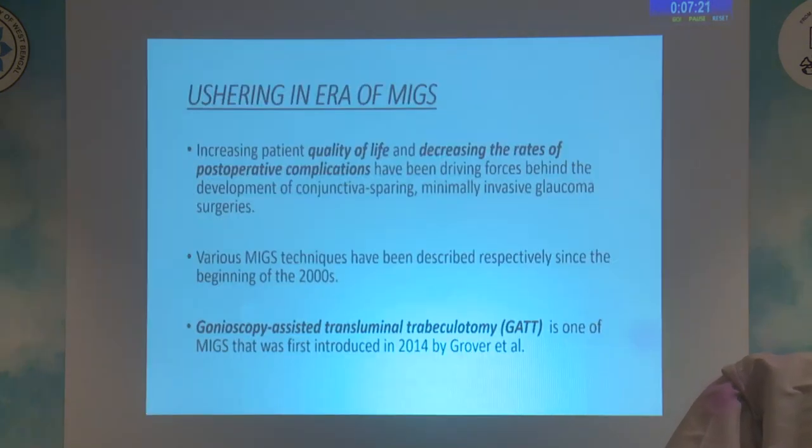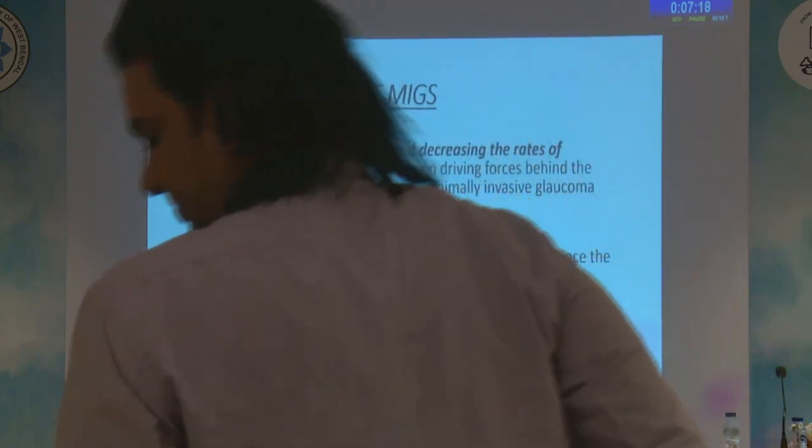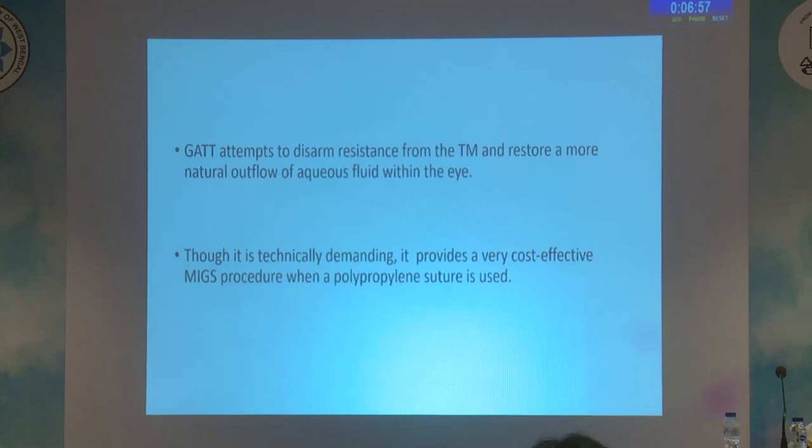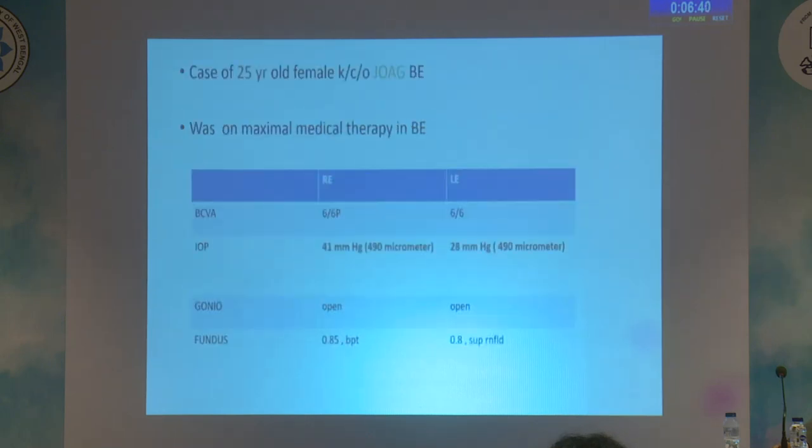Increasing patient quality of life and decreasing the rates of postoperative complications have been the driving forces behind the development of conjunctiva-sparing minimally invasive glaucoma surgeries. Various MIGS techniques have been described since the 2000s. Among those, the gonioscopy-assisted transluminal trabeculotomy was first introduced in 2014 by Grover et al. GATT attempts to disarm the resistance from the trabecular meshwork and restore a more natural outflow of aqueous fluid within the eye. Though it is technically demanding, it provides a very cost-effective MIGS procedure when a polypropylene suture is used. Let's look at some complex case scenarios.